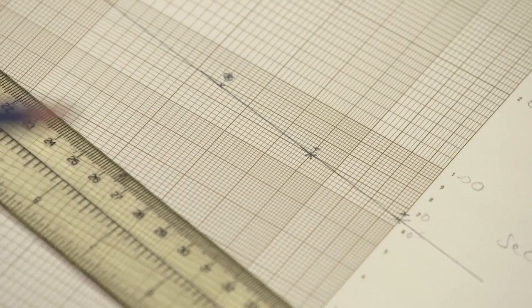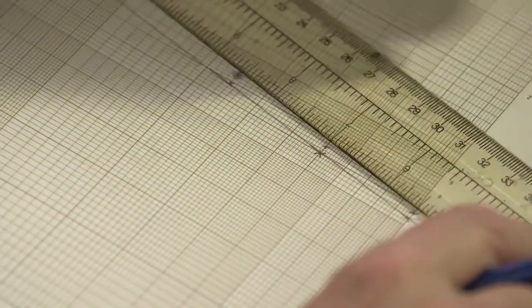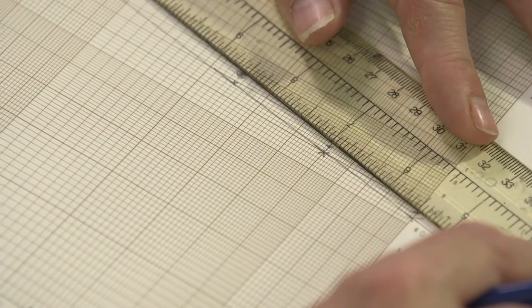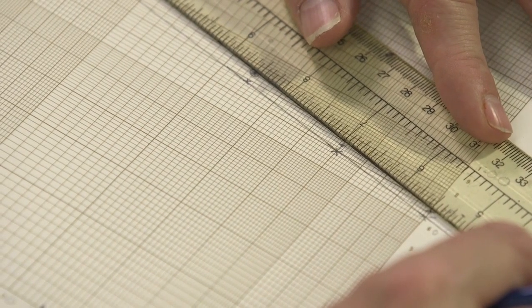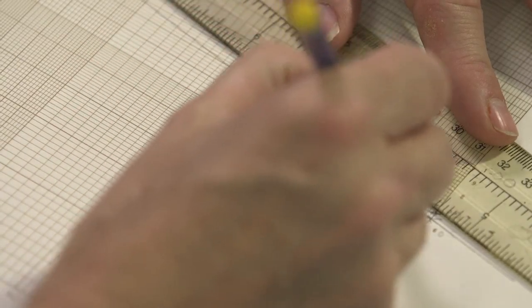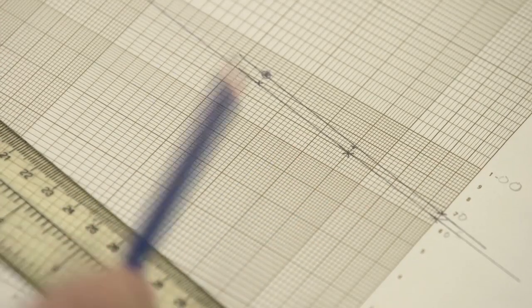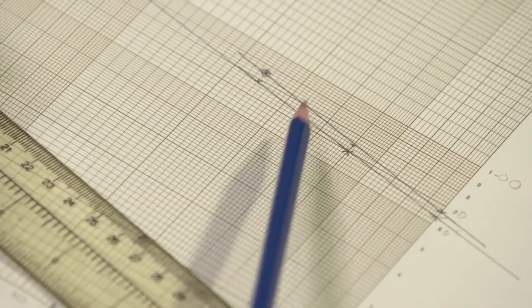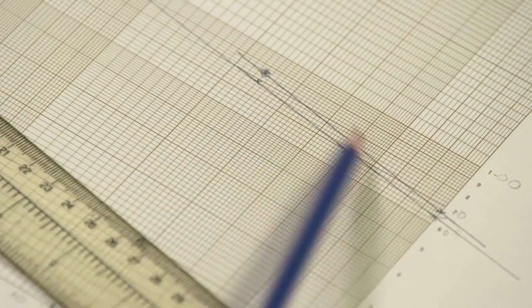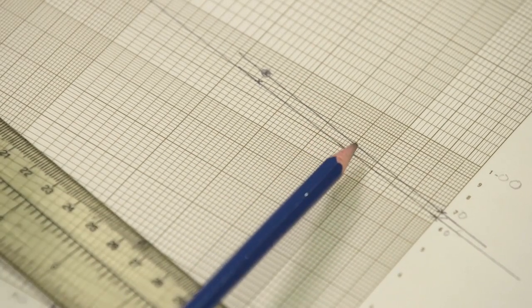Is it a straight line? Is it parallel to the standard? So we now need the best straight line, and the question, is that parallel to the standard? Is it a straight line? Yes. Is it parallel to the standard? Yes. Is every point exactly on the line of best fit? I don't think so, but very close.